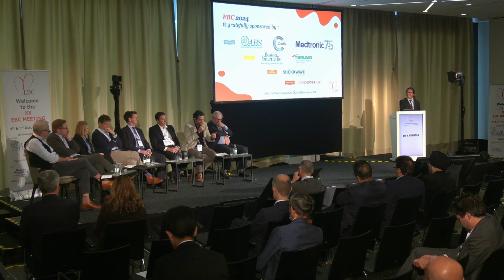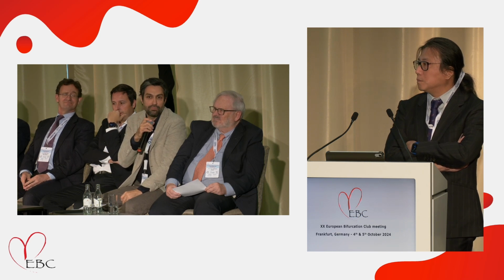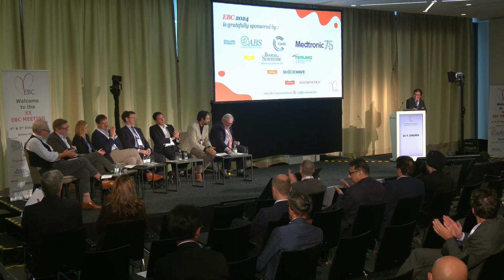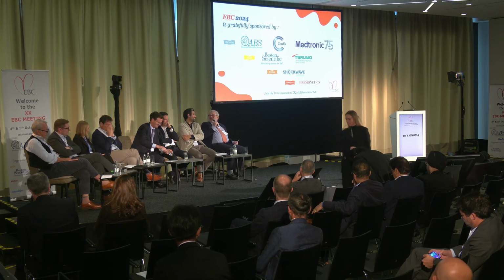I just want to make one last comment. For the question you made, Joanna, I think it's important: Professor Serruys and myself have been looking at all these angio-FFR systems and the simulation of FFR, specifically addressing the pattern of disease, which, as you know, is the next step in physiology. Last week we published the first validation, invasive versus angio-FFR, and basically you need the pressure wire. You need the pressure, that's the short answer. We started 1 year ago with this iconoclastic paper in JACC Interventions, and I think that the IMR will be the next victim in the process. But okay, let's go on.